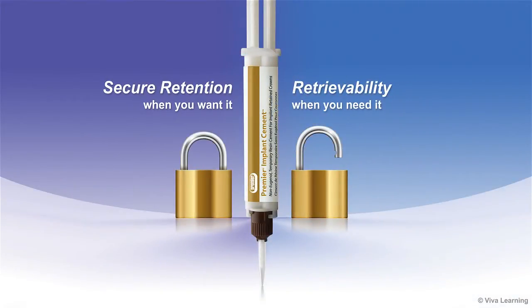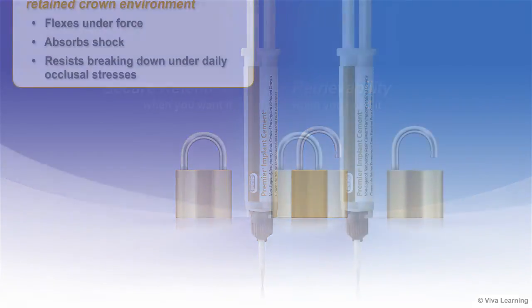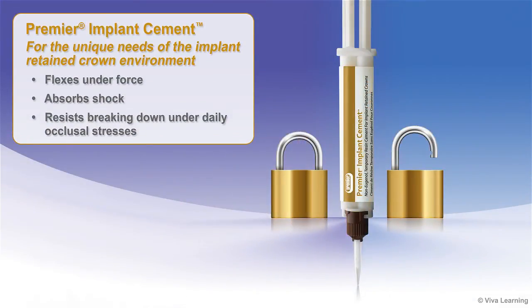Premier Implant Cement is a tough elastomeric implant resin cement designed to provide secure retention when desired and retrievability when needed. It was specifically designed for the unique needs of the implant retained crown environment. It flexes under force, absorbs shock, and resists breaking down under daily occlusal stresses.